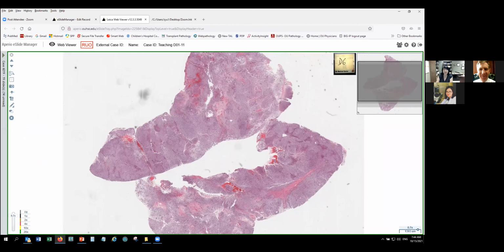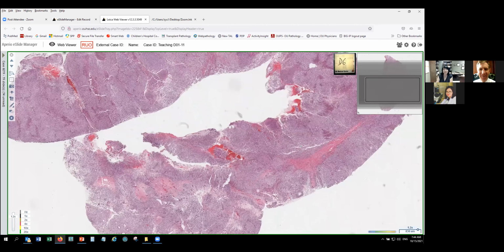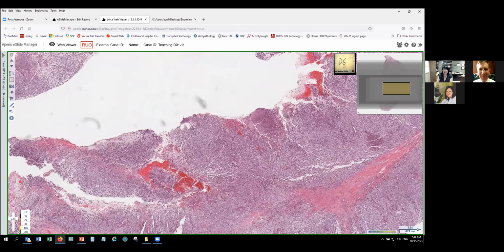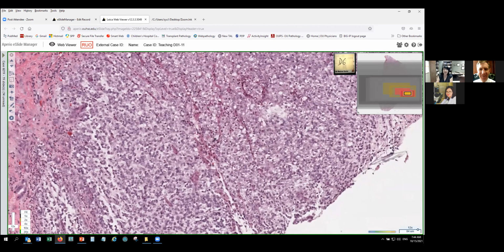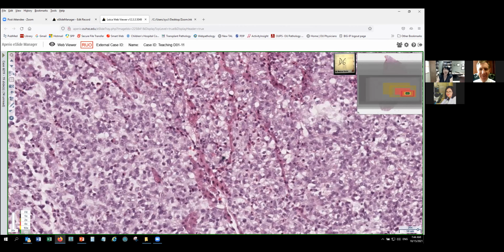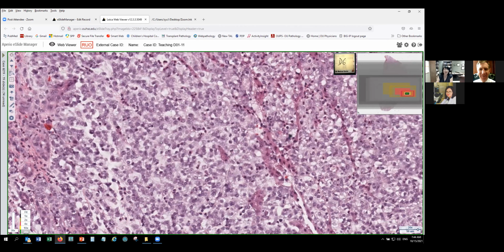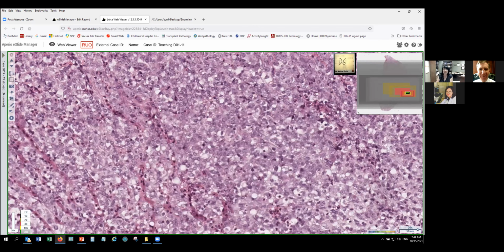On this specific scanned slide, I didn't find much normal liver, all tumor. And the sheets of tumor, you look closely. Maybe there are some entrapped hepatocytes, the pink ones. And on the right is a sheet of small cells, kind of no differentiation. You look around everywhere, it's just small blue cells.